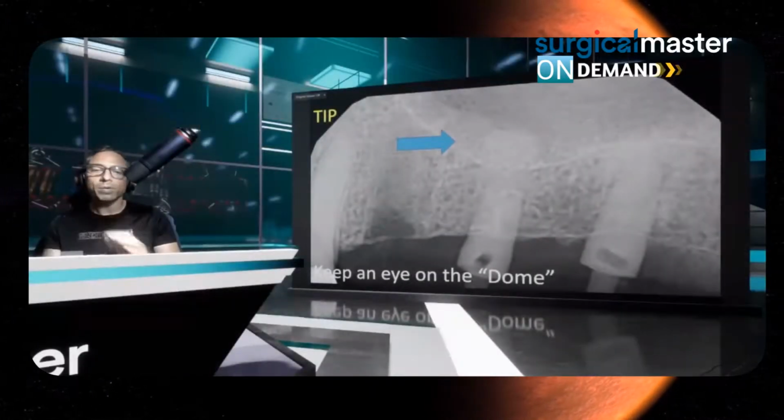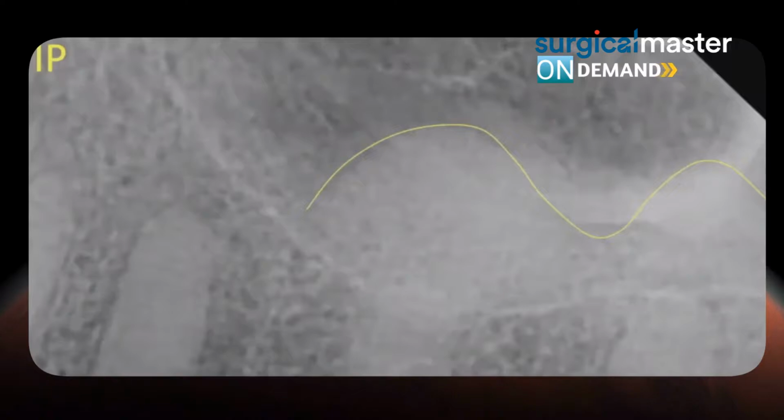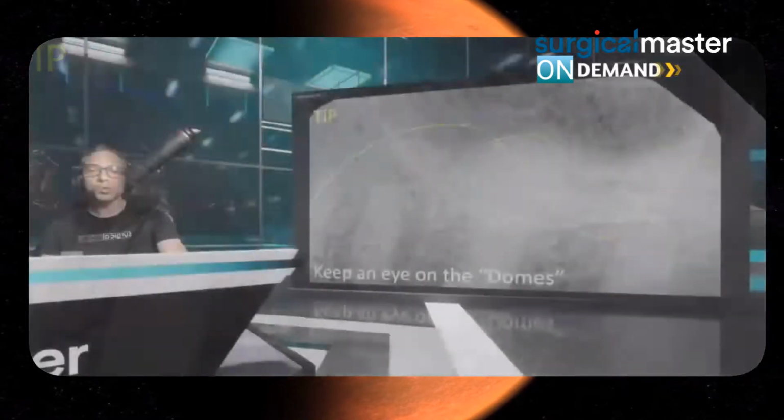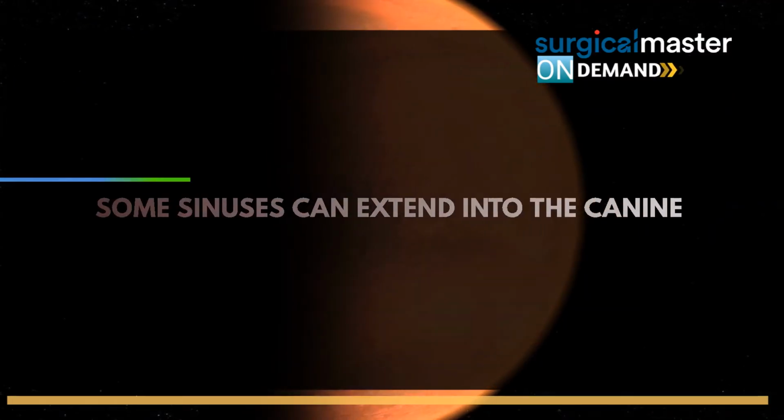So, when you start getting into more than one implant, you want to make sure that you have actually more than, you choose the lateral window approach. And again, not saying it's not possible, not saying I haven't done it. Obviously, I'm showing you multiple implants with 2 domes, 3 domes, but generally speaking, because sometimes if you over tap, if you over condense, if you're not careful, some of the bone graft can escape, and that needs to be managed. And there's a solution for that as well.